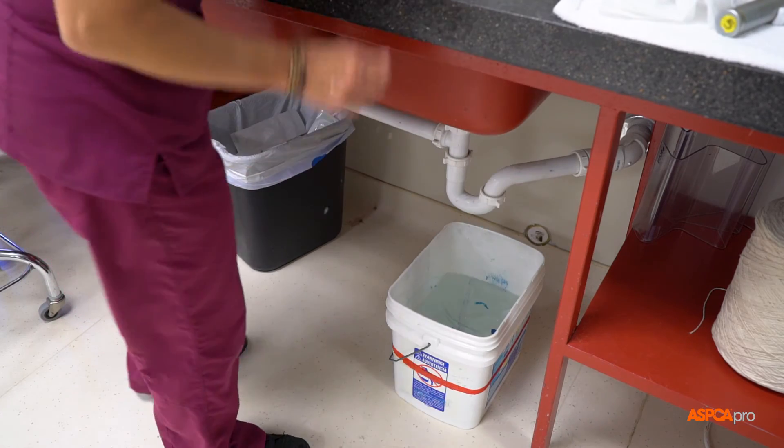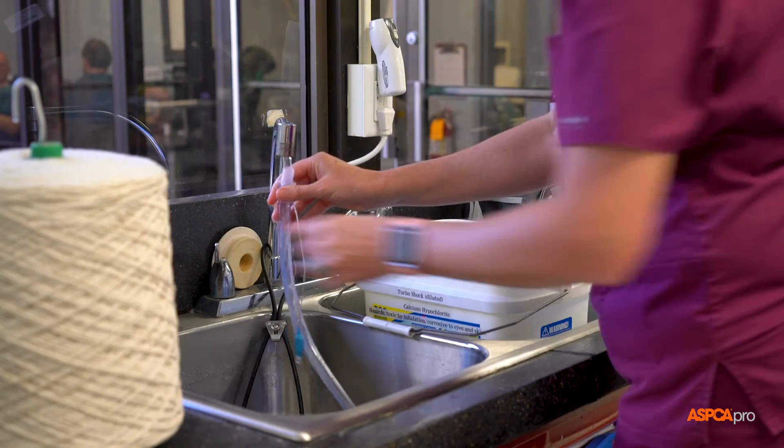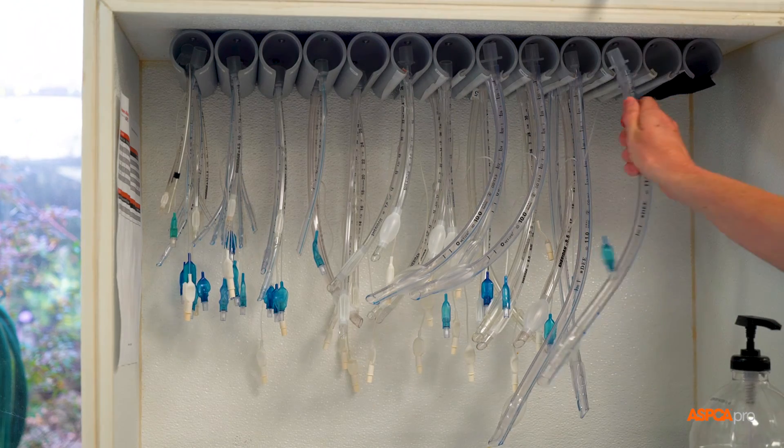Next, soak the tubes in the pre-prepared disinfectant bucket for five minutes, then rinse them and hang them to dry.